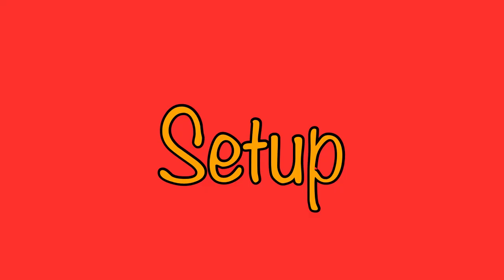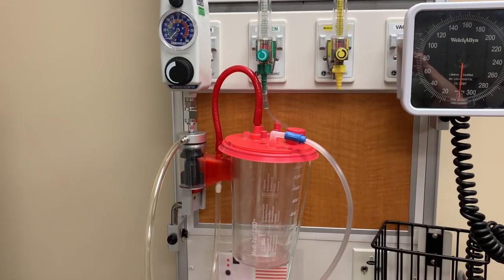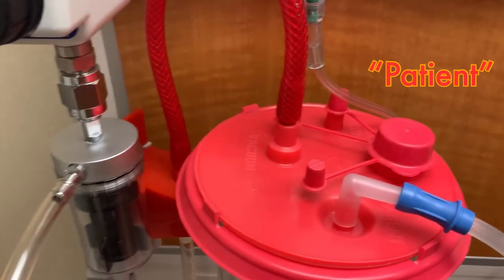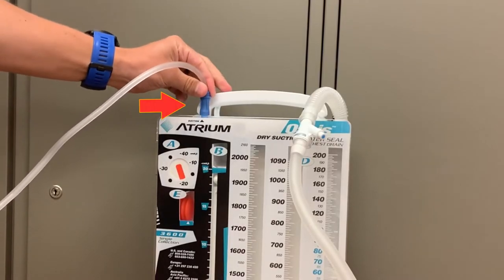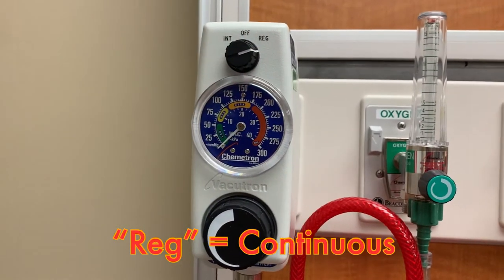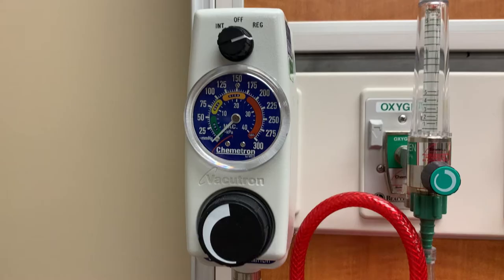When setting up the Oasis drainage system, begin with wall suction. Proper wall suction setup is demonstrated in a separate video entitled Setting Up Patient Suction. Connect the suction tubing to the patient port on the suction liner and attach the opposite end of the tubing to the blue port on top of the Oasis — the same port that was used to insert the water. Turn the suction control to REG. This will deliver continuous suction to the chest tube system. When setting up a chest tube to suction, continuous suction should always be used.